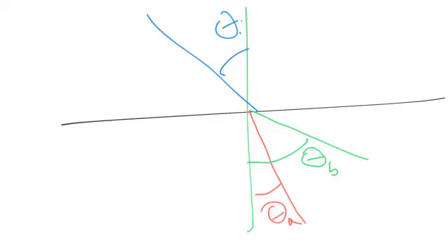Good. So this is important because of a couple of things. One is known as the duplicated aorta, but that's not so important. But this is more important here. Refraction can sometimes cause loss of signal.